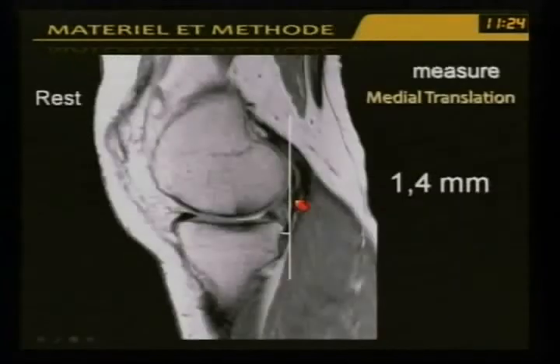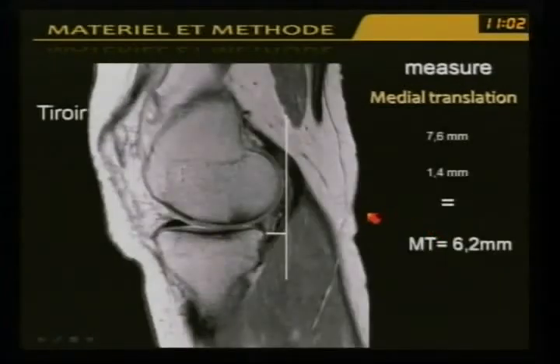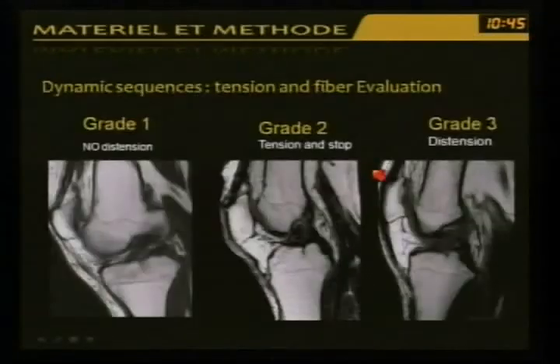the ligament. So we first measure the medial translation as we do on the normal X-rays, taking the posterior part of the femur, posterior part of the tibia, and we measure the value. It's of course not a side-to-side value; it's an absolute value. And then we measure the lateral translation, and we try to understand if we can measure the rotational instability using this type of device.